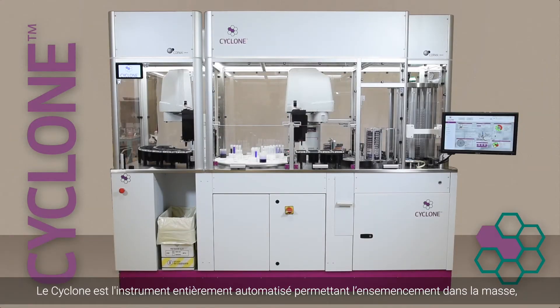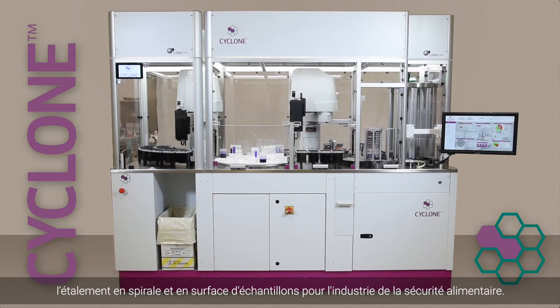The Cyclone is a fully automated instrument for pour plating, spiral plating and spreading liquefied samples for the food safety industry.